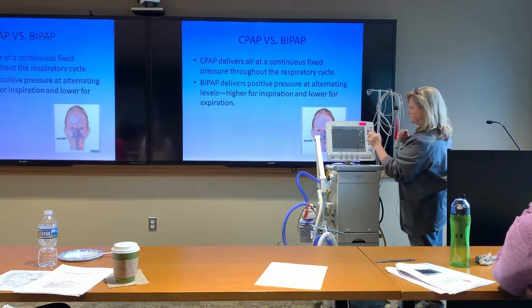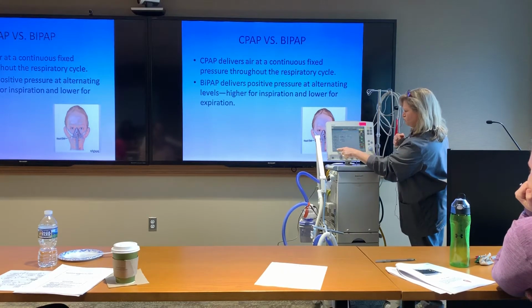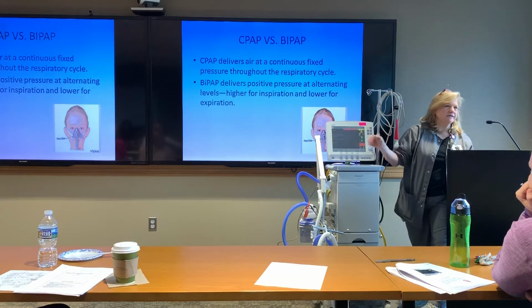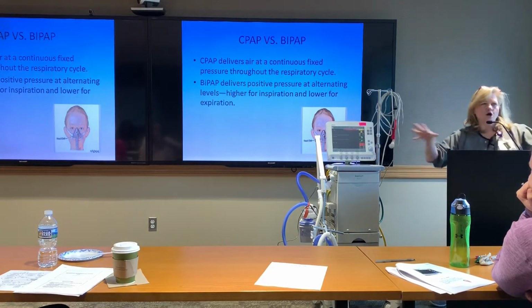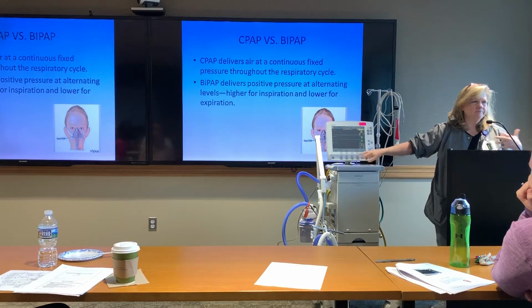Does that make sense? Oh, stop. I make it look easy, but it's really not that easy. Anyway, so if it's 0, it's CPAP.